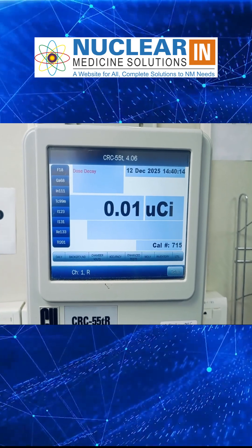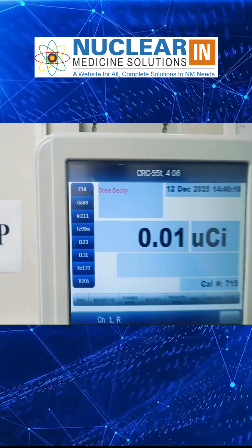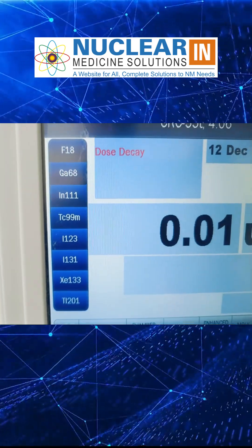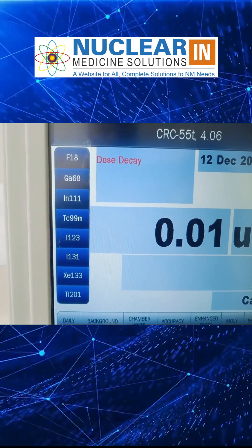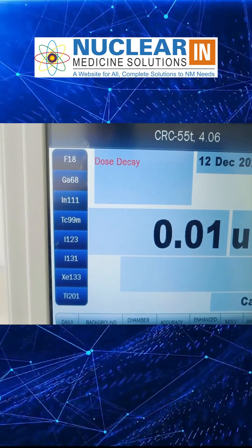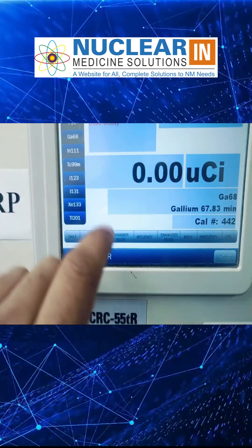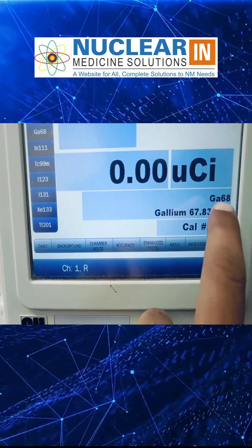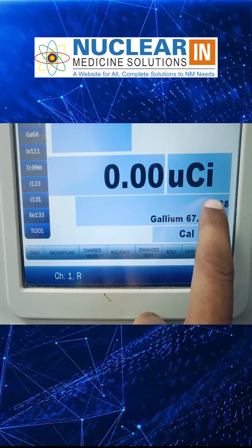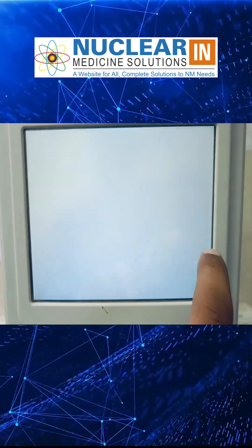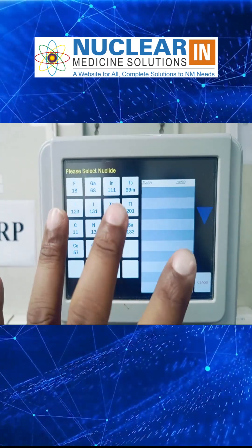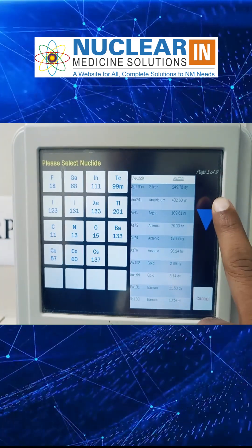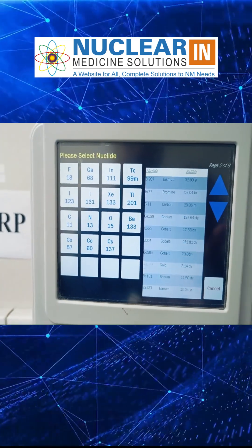For adding or changing the isotope, we have these many isotopes predefined. To change these isotopes — for example, Gallium-68 shows the isotope name here — we just need to click here and it will give a list of all the isotopes, and we can choose whichever one we want from this list.